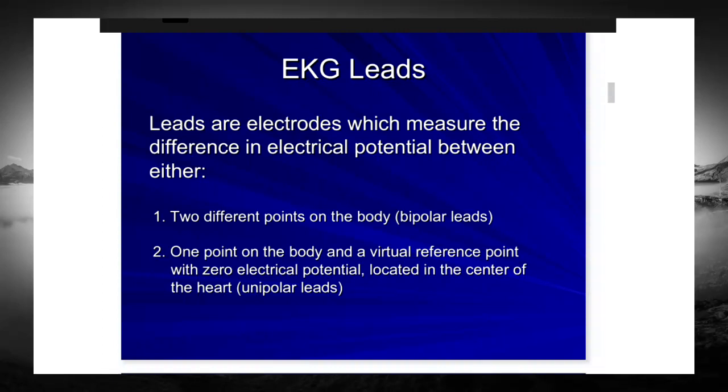Does anybody know how many stickers we put on patients? I hear 6. I hear 13. I heard a 10. And I heard a 12. So you meant 12, not 13. Okay. So what type of ECGs are they called? They're called blank lead ECGs? 12 lead ECGs. So, that does not necessarily mean that there are actually 12 leads.